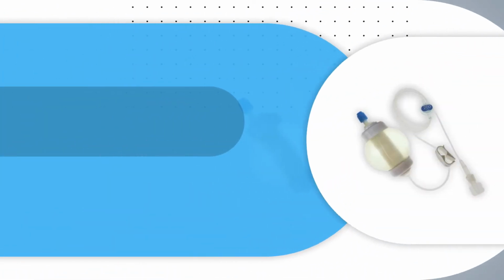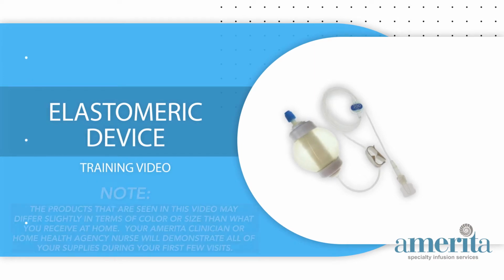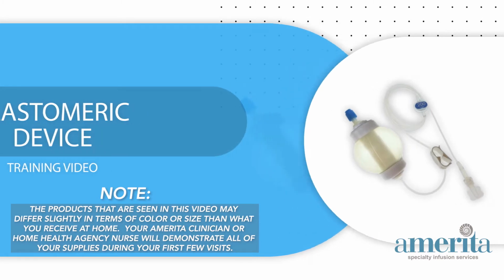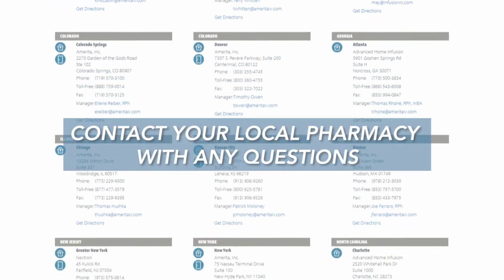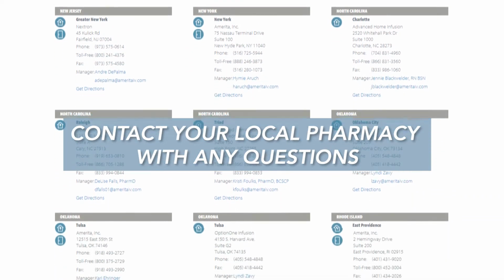This video will illustrate for you in a step-by-step process how to administer your medication through an elastomeric device. The products that are seen in this video may differ slightly in terms of color or size than what you receive at home. Your clinician or home health agency nurse will demonstrate all of your supplies during your first few visits. If you ever have any questions regarding this video or your supplies, contact your pharmacy. The number is located in your patient packet that you received with your first delivery.